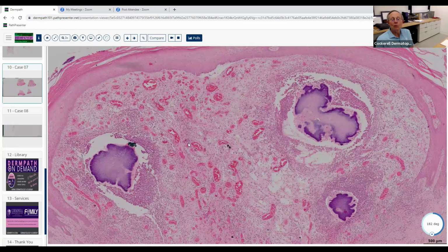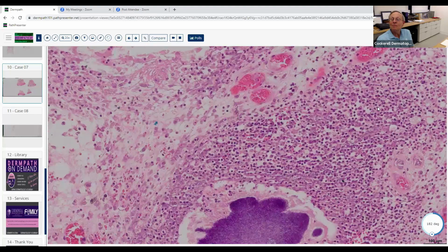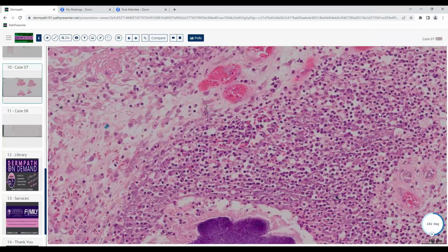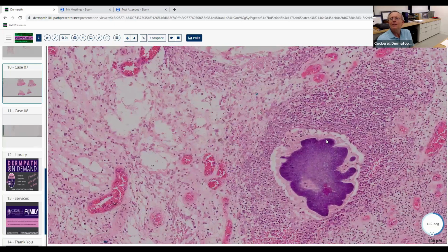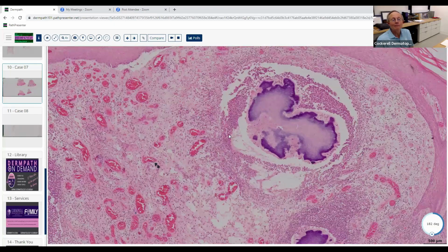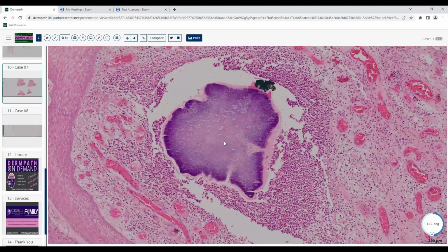There's definitely some granulation tissue here. What kind of cells are we looking at here? A mix of lymphocytes, neutrophils. Yeah, on a scale of 1 to 10, how many neutrophils versus lymphocytes and other cells do you see there? I would say there's a good amount of neutrophils in there, maybe about 95+%. Yeah, I agree. A lot of them. And so we think neoplasm still, and you can change your mind at any point, by the way. There are of course things that can mimic PG. You always want to rule out bacillary angiomatosis.